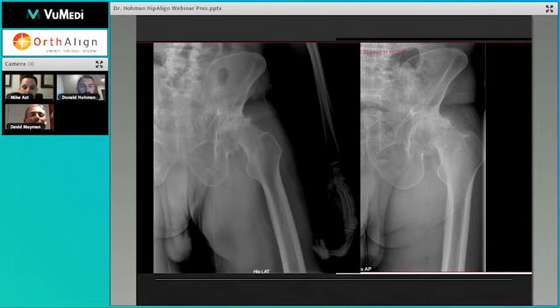Again, when you dislocate this hip and you're looking inside there and trying to identify something that's going to provide you with some keys as to where you might be in space. Again, with a larger patient, this can be challenging, and this is again where I found this technology to be really quite helpful. I think that the benefits in the larger patients, especially in the posterior exposure, can't be overstated.